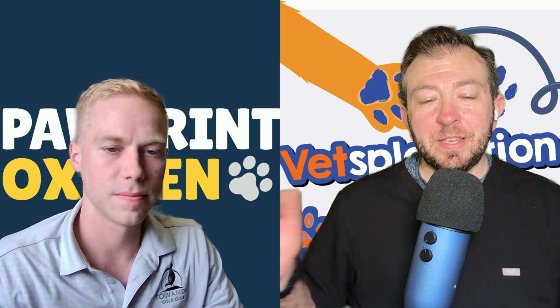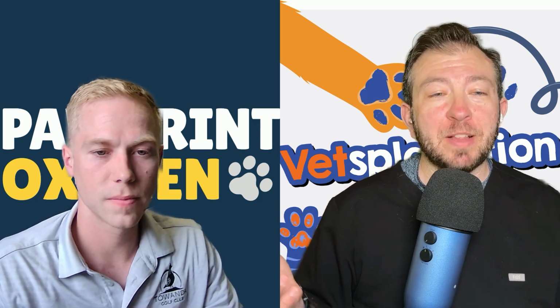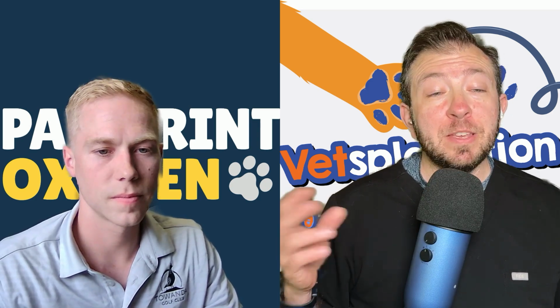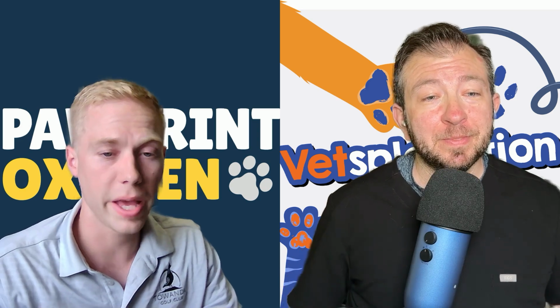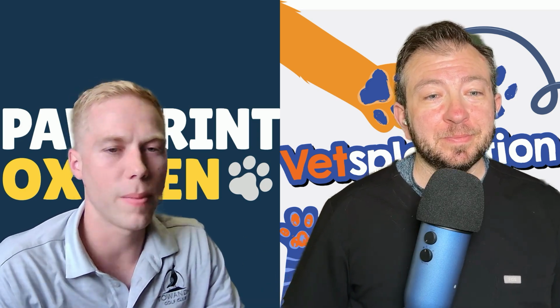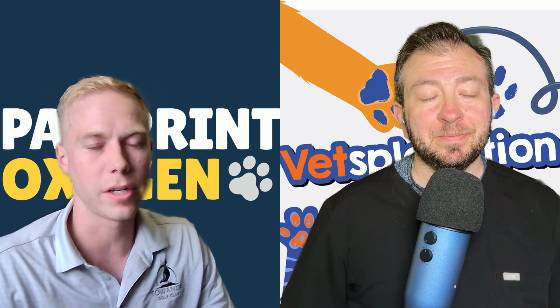What about the oxygen chambers? So I have actually talked to people who breed brachycephalic dogs, again, so flat-faced dogs, that they use it for their little babies, the neonates. Yeah, exactly. And that would be a good example of when you might need, let's say, hours of oxygen compared to minutes. And that's how we differentiate these.